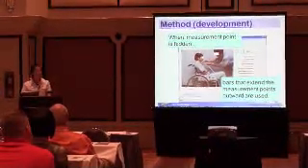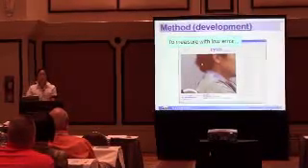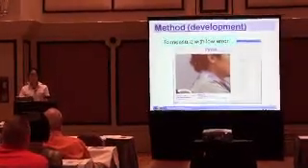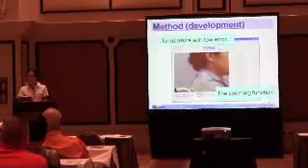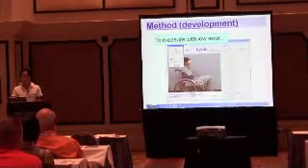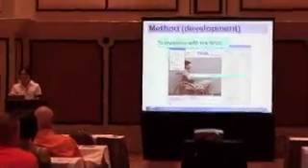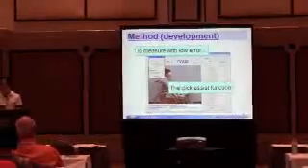Here is the bar. And to measure with low error, you can zoom in on the picture. We name this the zooming function. To measure with low error too, we have the click assist function. And here is the software keyboard.